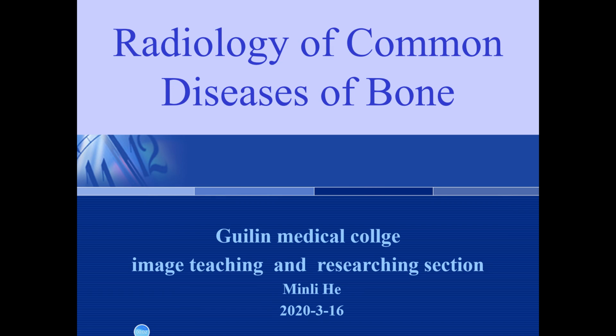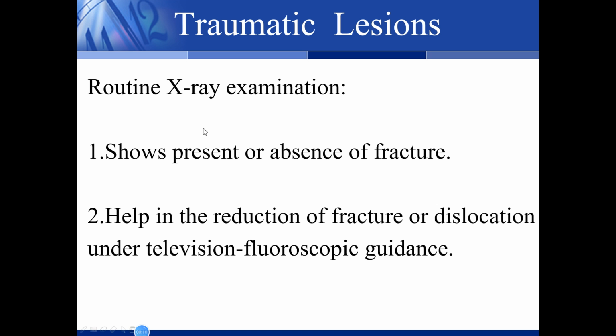Good morning, everyone. This time we will learn about the radiology of common diseases of bone. First, we will learn about the traumatic lesions. Routine X-ray examinations.